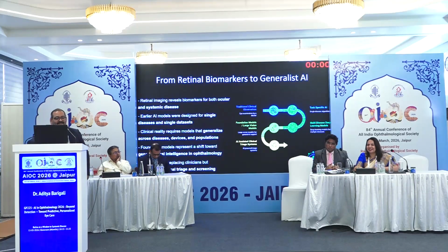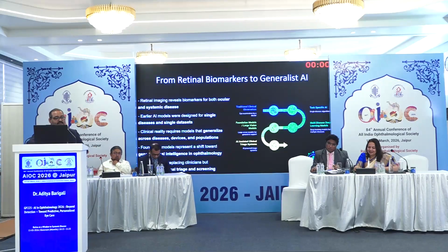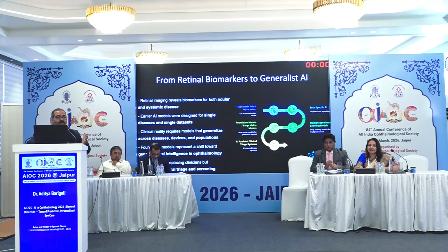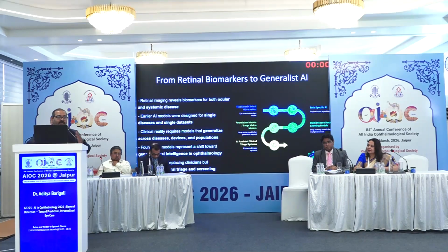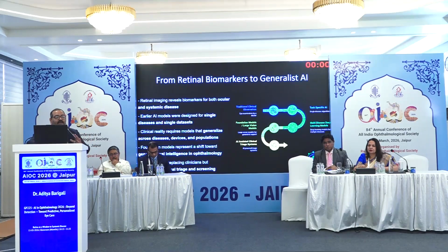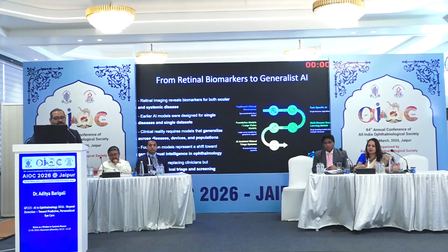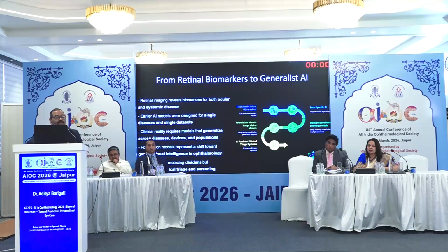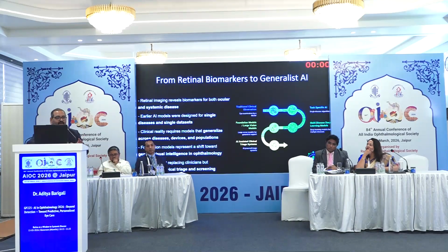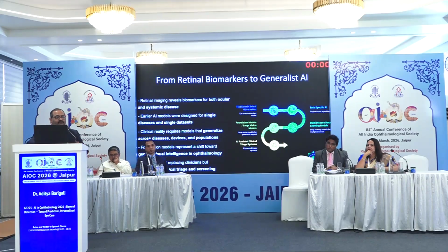Essentially, the clinical reality requires the models to generalize across diseases, devices and populations. Any ophthalmologist can infer from a fundus photograph taken on any fundus camera, and still the diagnosis is right. AI can't do this yet. So the foundational models represent a shift toward general visual intelligence in ophthalmology, which is roughly about a PG grade diagnosis. It misses a lot of times, but when it is right, it is usually right.